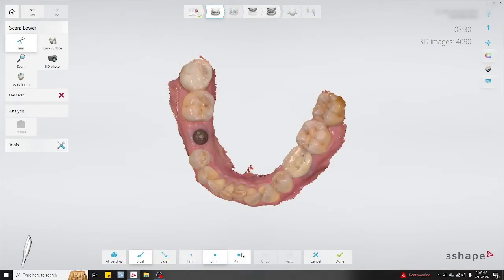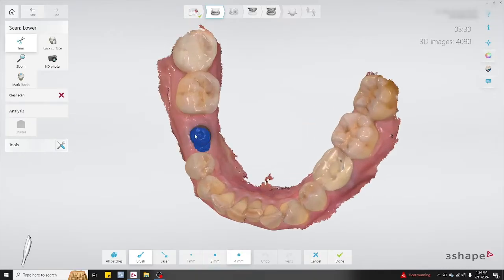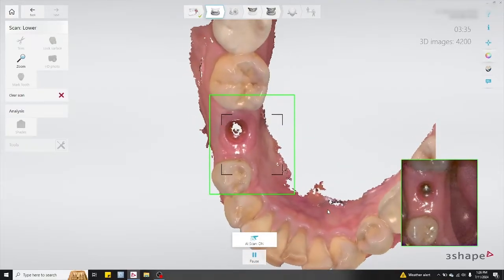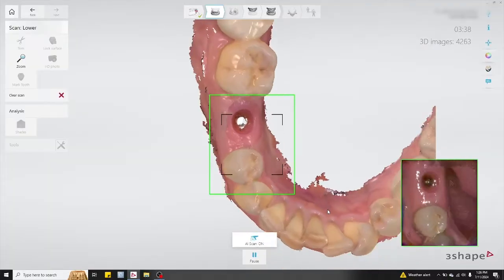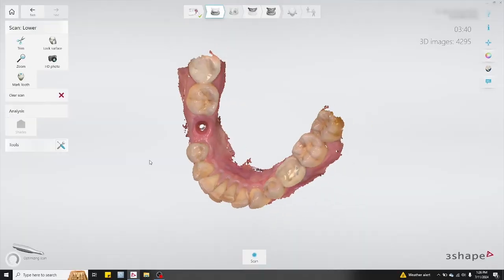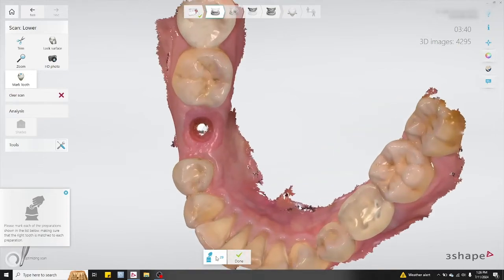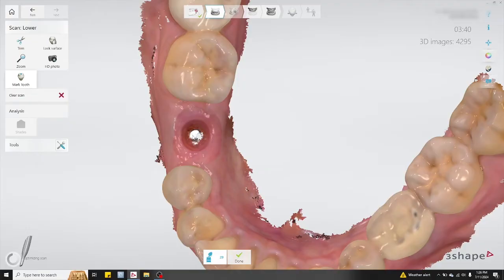Once you're satisfied with the scan, click on the trim button and cut away the healing abutment portion of that scan. Once that's done, remove the healing abutment from the patient's mouth and re-scan that area to pick up the emergence profile of the implant. When you start scanning, make sure you're starting on the occlusal surface of the adjacent tooth so the software can quickly recognize where you are in the arch. You may not actually pick up images of the actual implant surface itself, because it's metallic and reflects too much light — so it's not important to capture the implant itself. Rather, the purpose of this scan is to capture the emergence profile of the implant site.